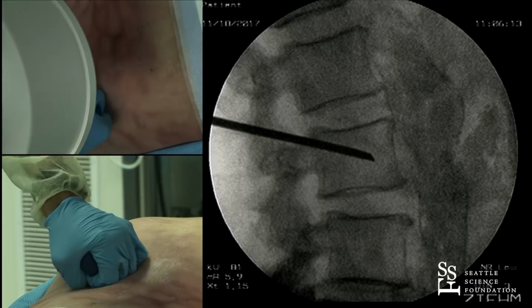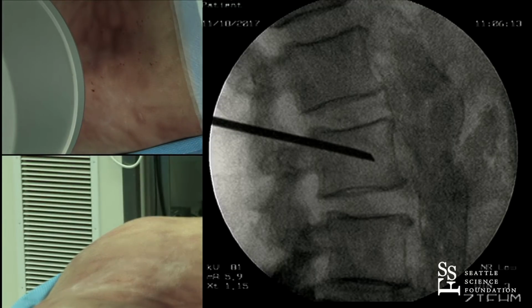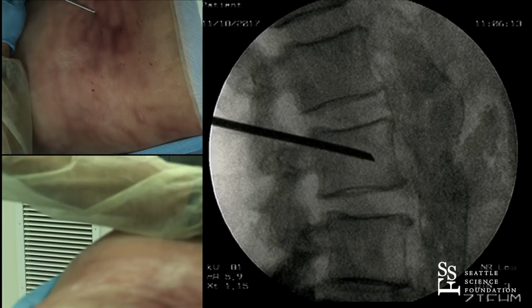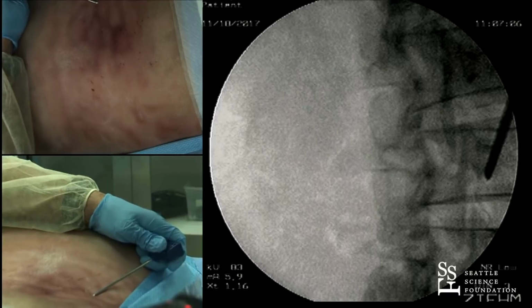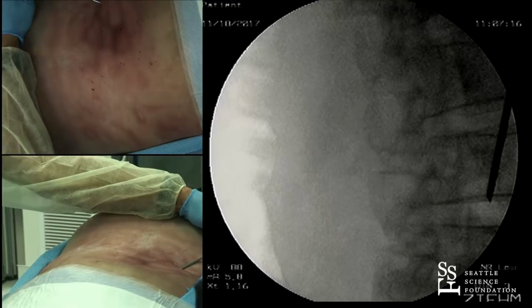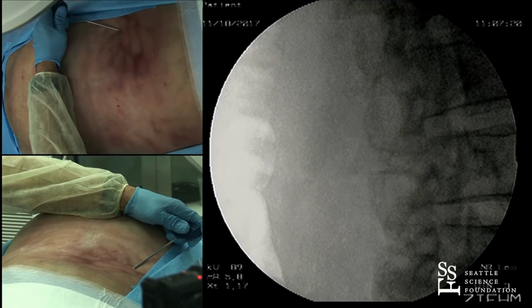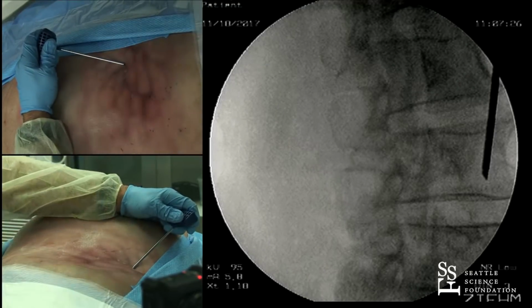So this will be a little bit different approach. I'm going to do the modified inferior end plate extrapedicular approach. So what I will need is 45 degrees towards you. All right, so at an angle the other way. So I'm going to pull towards you. Good. So at an angle like this, at 45 degrees, our start point is right there.